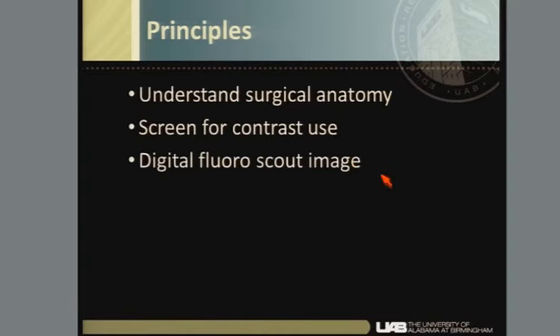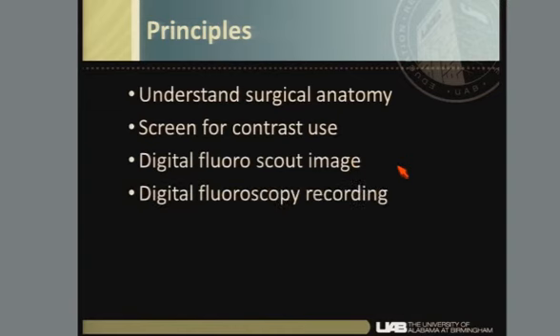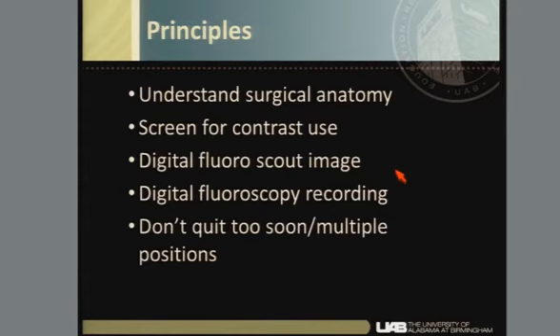Really, each patient needs a scout image, and we'll talk more about this in a moment. And I recommend recording these as well. Sometimes you're able to capture information and you can go back and view the video recordings. I think this is very important because sometimes you get one specific moment, and if you don't capture that on the image, you may miss the opportunity to make a definitive diagnosis. And again, I think that should be the goal. If we give an equivocal report for our surgeons, we haven't helped them.